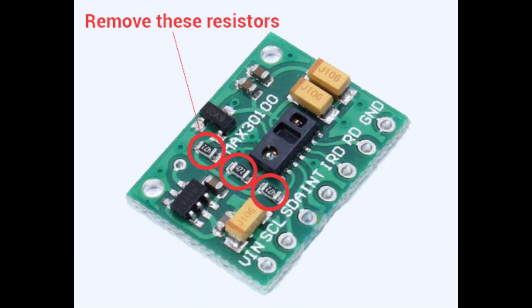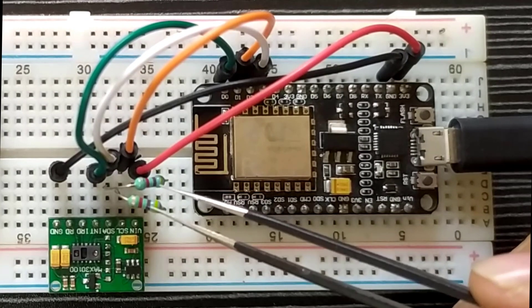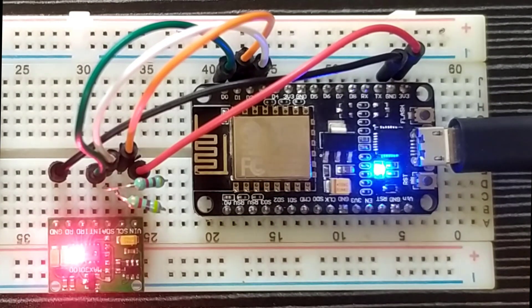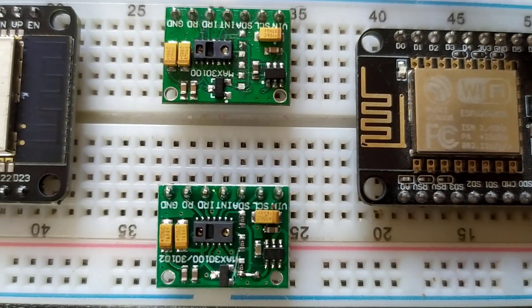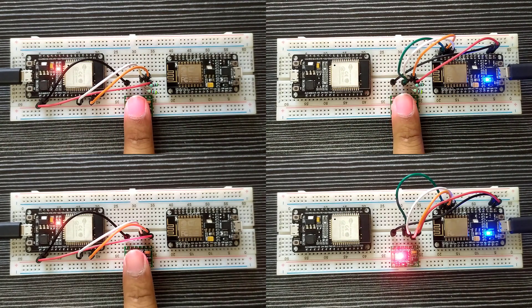Method 2: simply remove these 3 resistors and connect external 4.7kΩ resistors on a breadboard. You don't have to cut the PCB lines with this approach. Choose your feasible method and just do it. After successfully completing either method, connect your sensor to any microcontroller and test it. I have followed both methods with two different sensors to demonstrate. Both sensors are working absolutely fine, giving accurate heart rate and SpO2 data seamlessly with both ESP32 and ESP8266 modules.